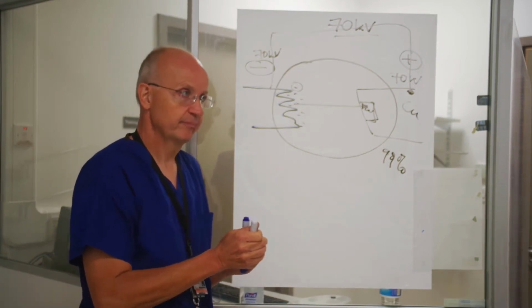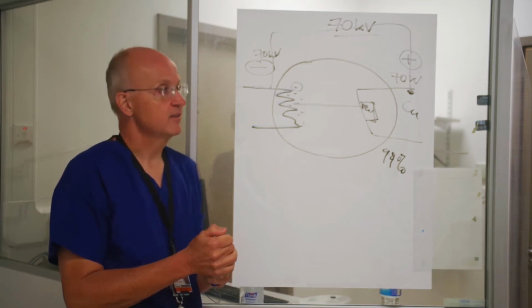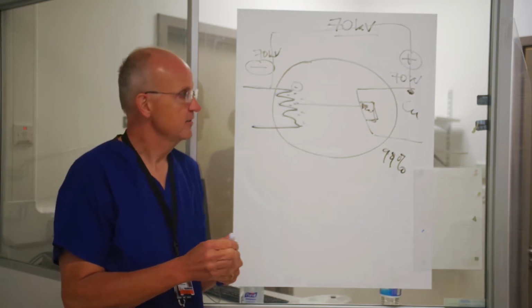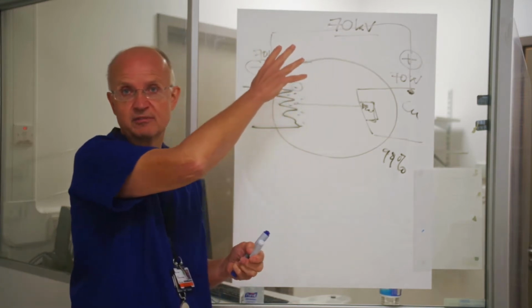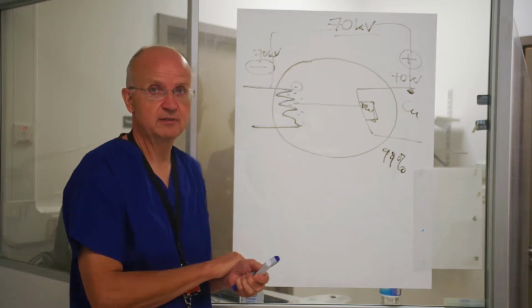But doesn't the oil also provide insulation? It does, very good. So electrical insulation as well. Yeah. It does. But yeah, good point, Sarah. So it also gives protection as well to the operators. 'Cause remember, we've got 70,000 volts here. We don't want that to break down. So we've got a good insulator as well.